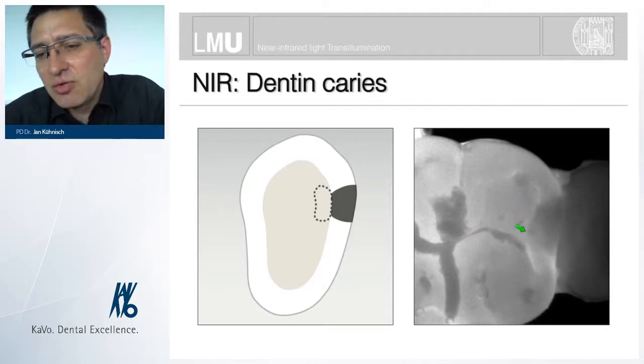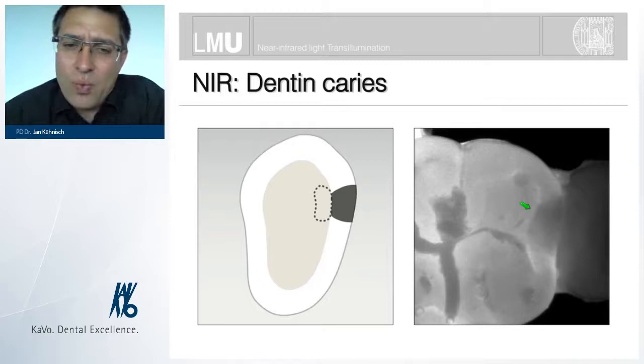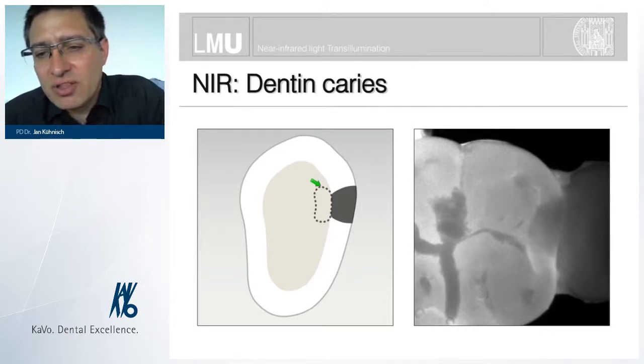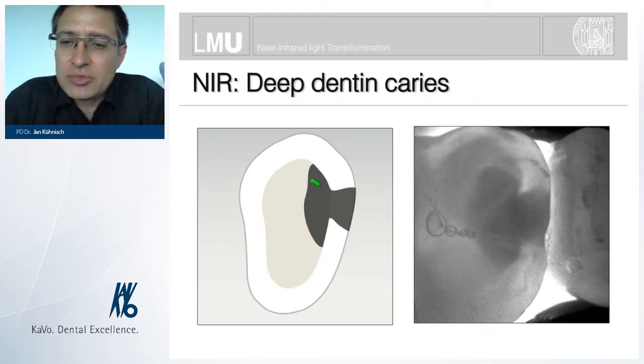You see here that the demineralization reaches a long distance along the enamel-dentine junction, and it means that the enamel-dentine junction is reached, it's infiltrated, is perforated, and we don't know, as there is no definite clinical sign of an existing dentine caries lesion, but we can assume, and we had seen this from our study results, that all of the cases which were treated were linked with a dentine caries lesion. And I had shown you such a case just before.